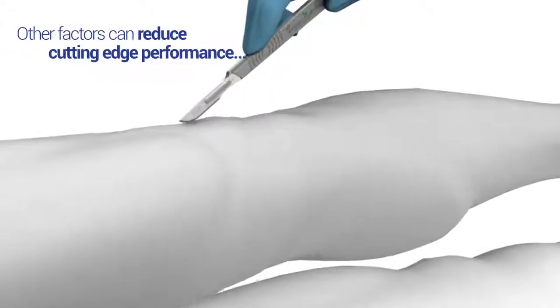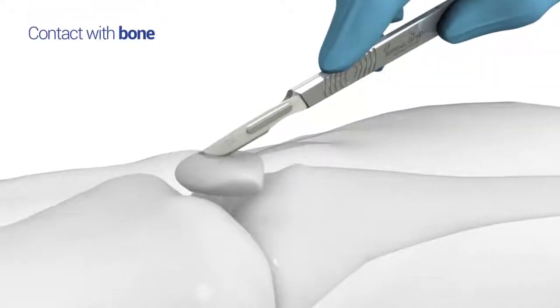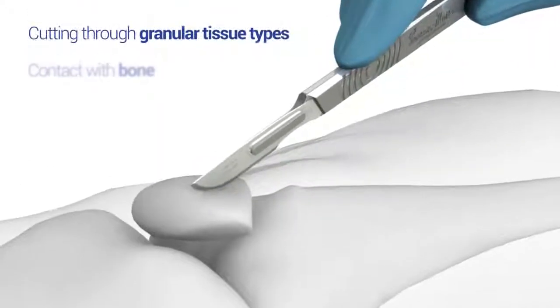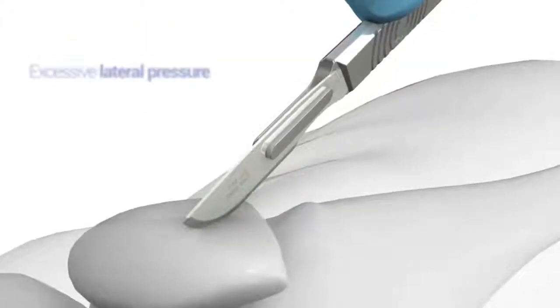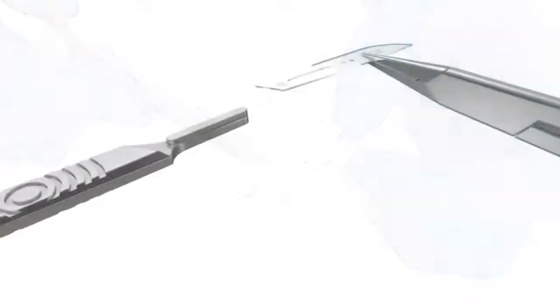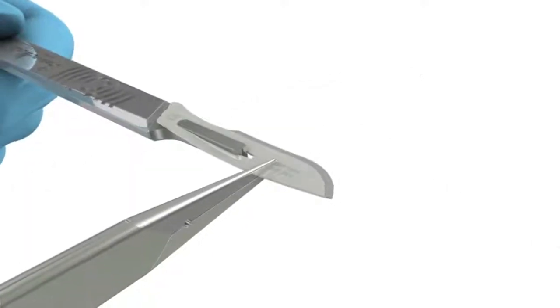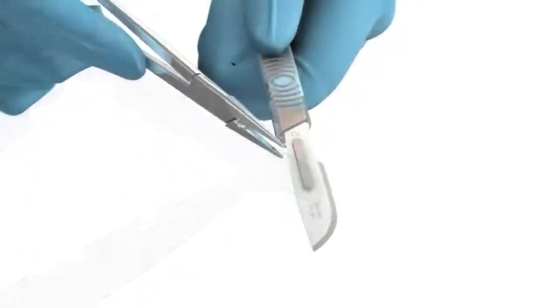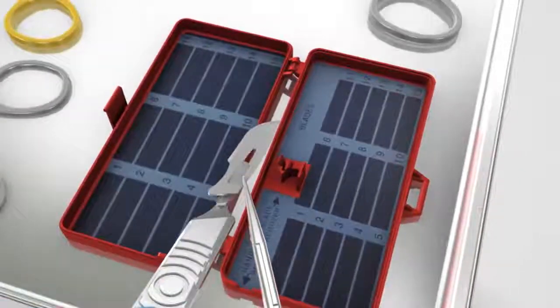The cutting-edge performance can be further reduced during usage by contact with bone, cutting through granular tissue types, or by exerting excessive lateral pressure. Following these simple guidelines to best practice both maintains the durability of Swann Morton surgical blades during usage, whilst supporting safe handling procedures and protocols within the healthcare environment.